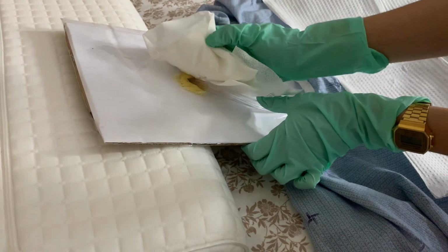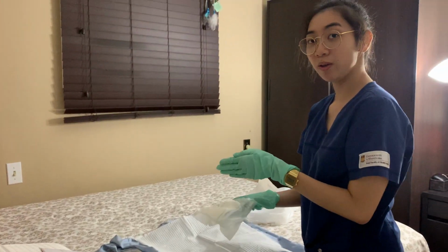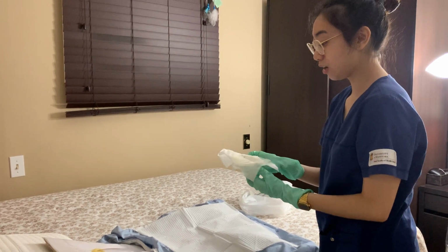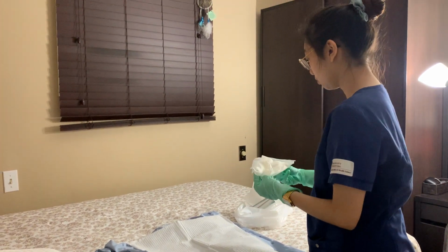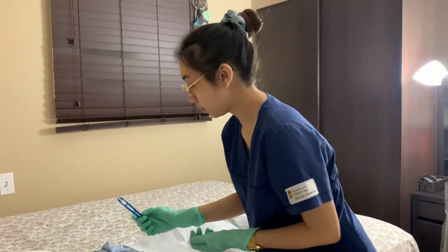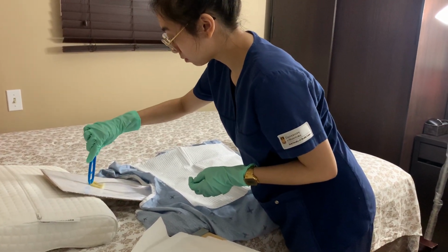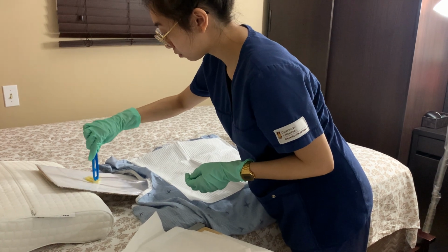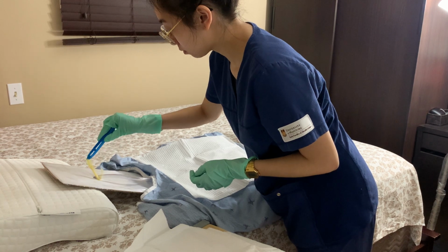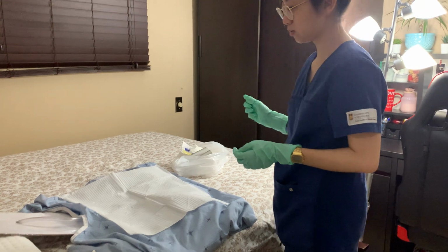Okay, now I'm going to remove my dressing. Okay, and as I'm removing my dressing, I will be assessing my old dressing, and I can see that there is no drainage, which is good. So now I can just discard this in the garbage. I'm going to grab my forceps and remove my Jelonet. Okay, and I can just throw that in the garbage as well.